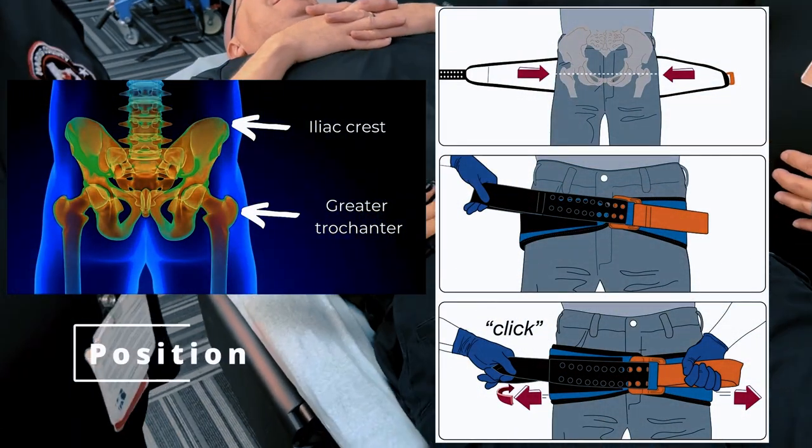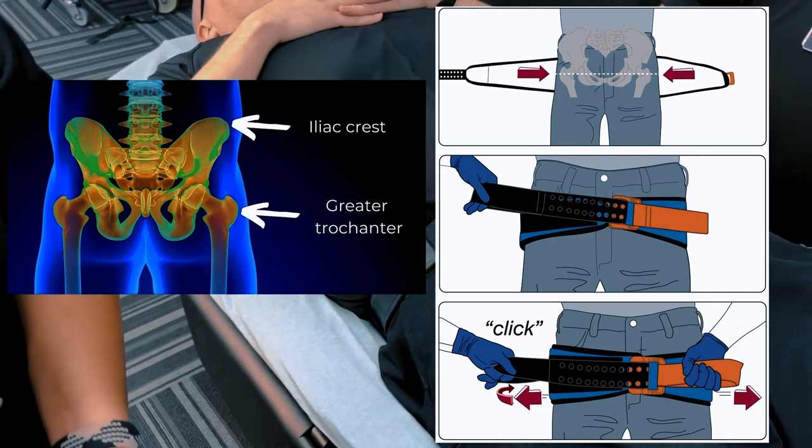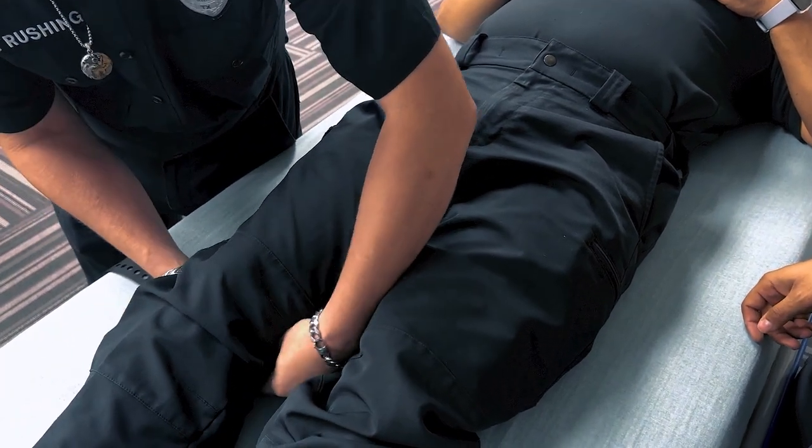The pelvic binder should be slid underneath the patient's posterior hips and positioned at the level of the greater trochanters. The binder should be centered on the front of the pelvis, with the ends of the binder extending toward the back.